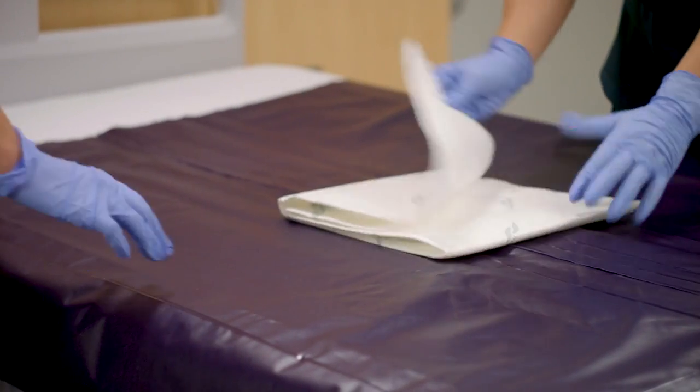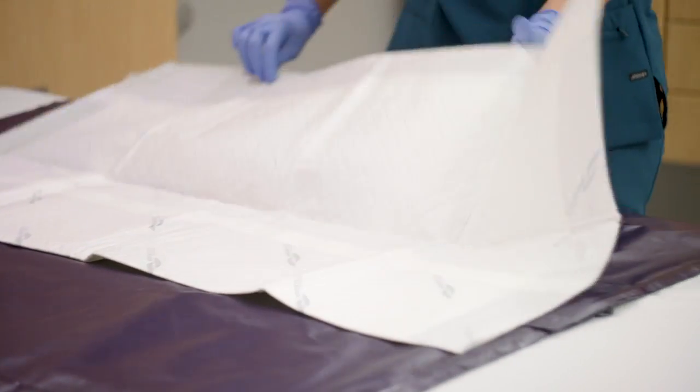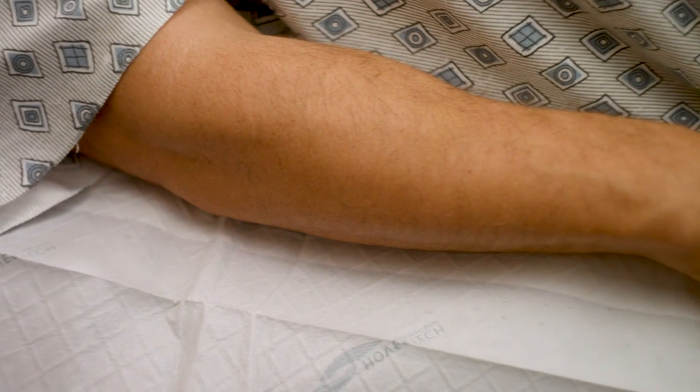Each Q2 Roller comes with five Q2R pads to protect the surface of the device. The Q2R pads are absorbent and breathable to wick away moisture and help control the microclimate of the patient's skin.